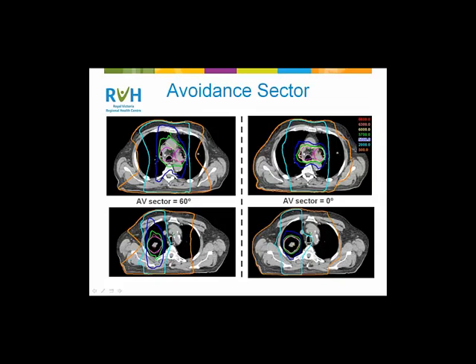For the AP/PA plan and RapidArc, was the same isocenter used for these plans? Yes, we do use the same isocenter for these plans, and the way the isocenter is chosen is, in the superior-inferior direction, we try to put it around the center of the PTV. In the AP direction, we try to keep it roughly midline, and in the lateral direction, we try to keep it within 4 centimeters of the midline of the patient. The reason we do that is to be mindful of the potential for collisions, but it also helps in that when we cone beam the patient, we don't have to move the patient out of the OBI safe zone, so the couch doesn't have to move. If you've done that on the Varian units, you've seen it does that automatic couch motion. It's very jerky at the start and stop of motion, so we try to avoid that as much as possible.